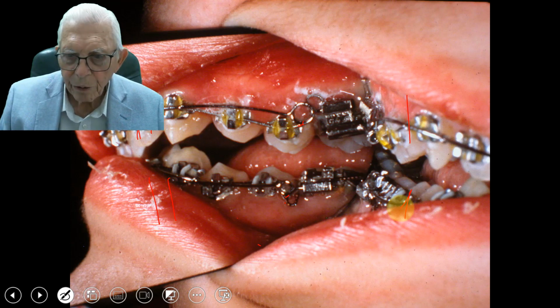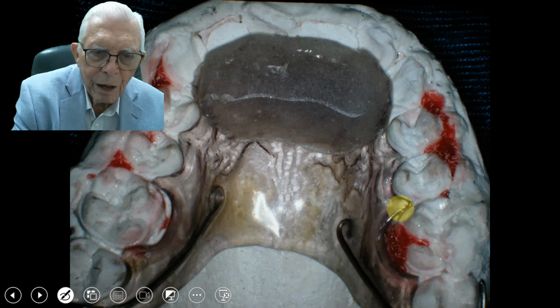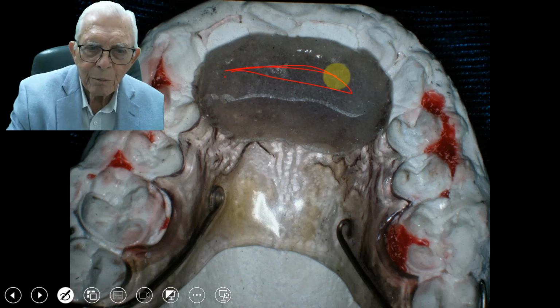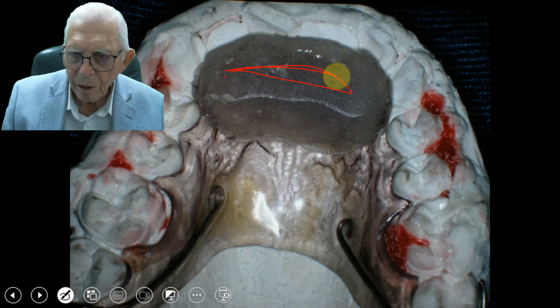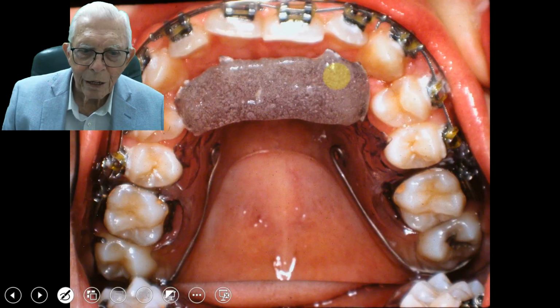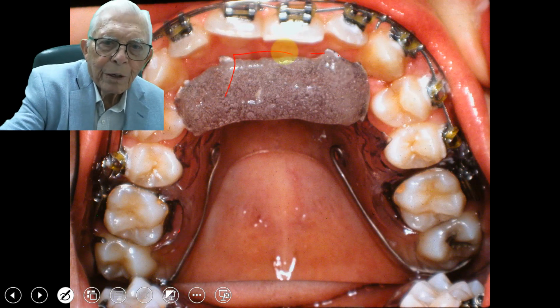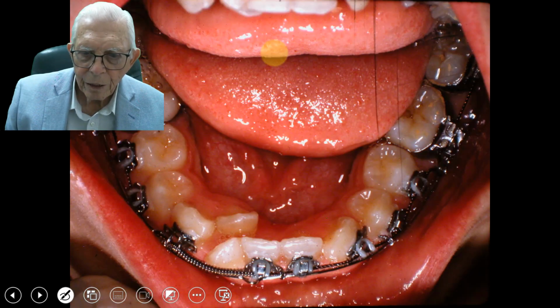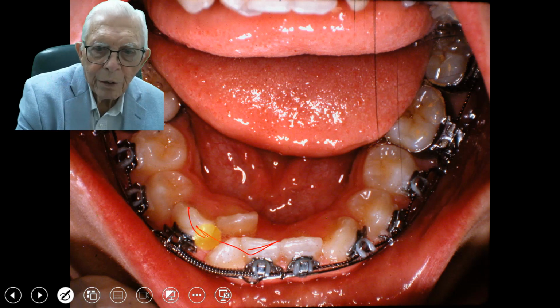All right, this looks complicated, but we made a removable appliance that we put in there and put a ramp on it. And that makes him bring his jaw to the front out here. That looks pretty complicated. Now that's not in its place. Actually, this ramp goes on up in here and he brings his jaw up that way and that holds the jaw forward. We expanded this area down here.